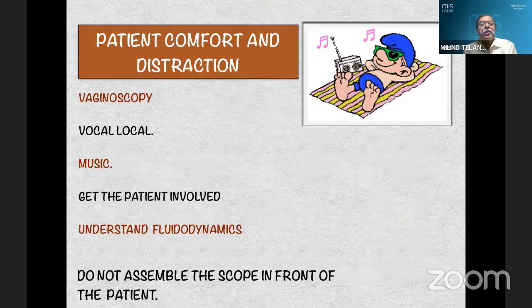So what is important to us? Vaginoscopy, no speculum to be used. That is most important, so learn the art of vaginoscopy. Go inside the vagina without catching the vulva. Mind you, it's a no-touch technique. Don't catch the vulva to increase the pressure in it. Very rarely, if it is a capacious vagina, you might, but that is a rarity. Go down. I'll show you the technique also.